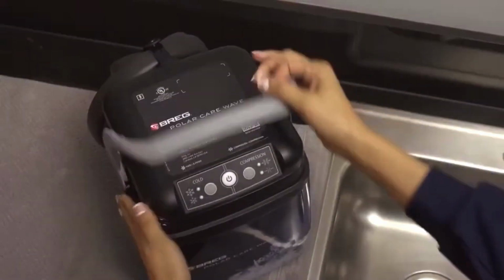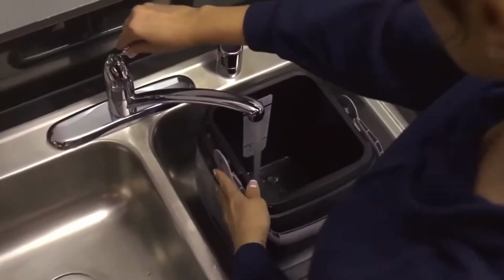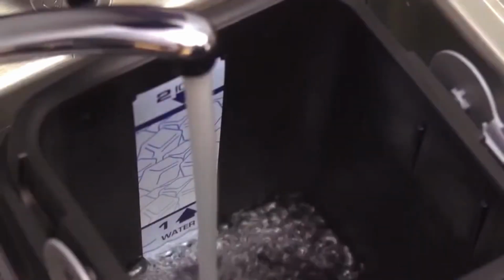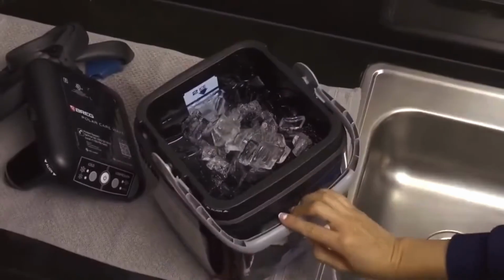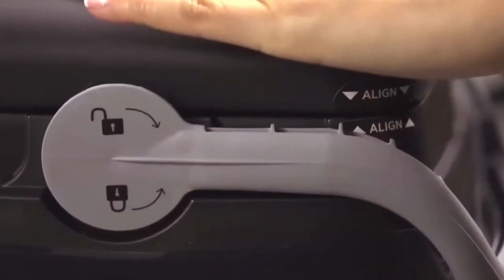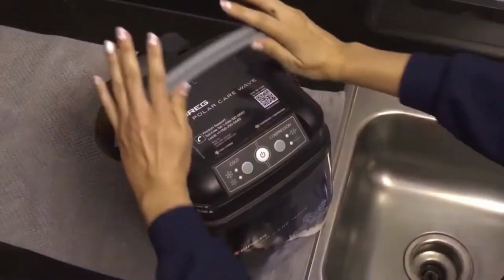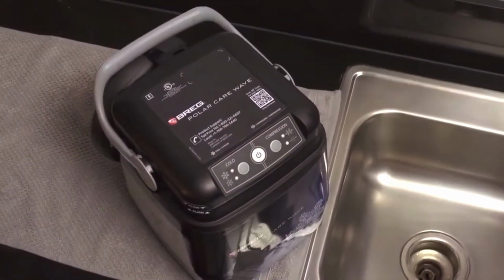Unlock the handle by rotating it to the front of the container. Remove the lid and fill the container with water first, then cubed ice. Water and ice fill lines are located inside the cooler. Place the lid on top of the Wave container using the aligned stickers with the handle in the unlocked position. Once the lid is in place, rotate the handle into the locked position.